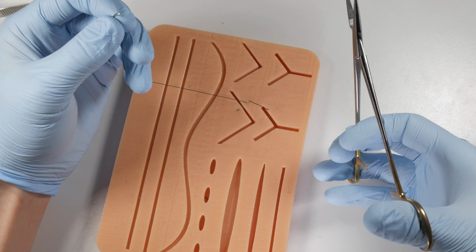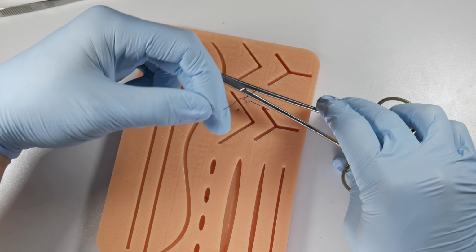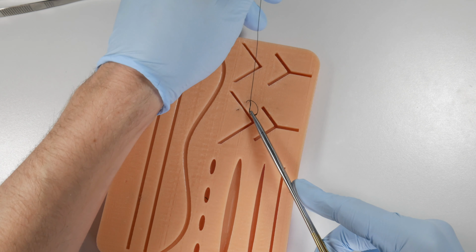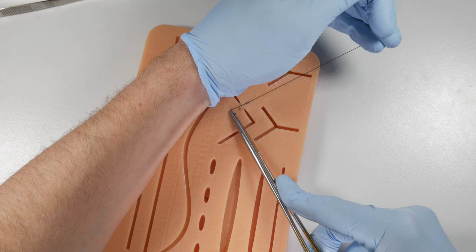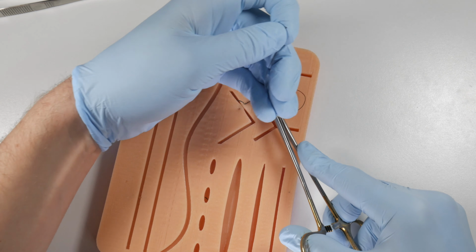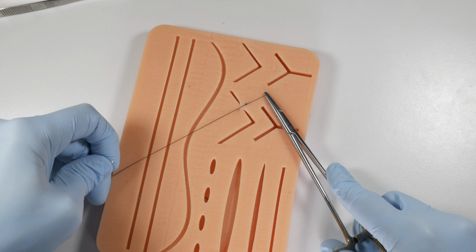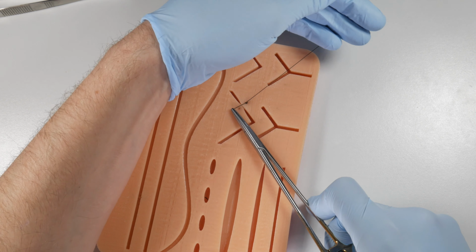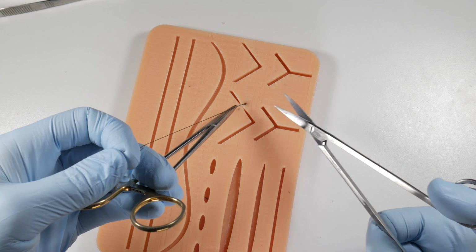Now, to tie up this knot, basically we're going to just control the needle again in our non-dominant hand. We're going to do 2 passes clockwise over the needle driver, grab the tip of the short end, and pull things together and apply a little bit of tension, which is going to bring the edges of the incision nicely together. We're then going to come back here with a counterclockwise motion, grab that tip, pull it together. Final one here, we're going to go one more time, back the other way, and we're now ready to clip that off. That is our vertical mattress suture.